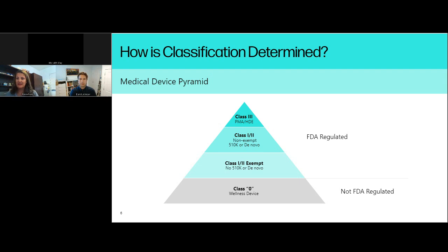That can be anything from temporal, mandibular, and cranial devices. I know that interbody fusion devices are patient-specific, and I know that we're moving down through all the joints. So there's a little bit more effort, not just one single battery of testing meeting the criteria of substantial equivalence, but really looking at the maximum volume and minimum volume with footprints attached to make sure that anything printed inside those constraints is going to be safe. That's the biggest difference between a subtractive device and an additive device.